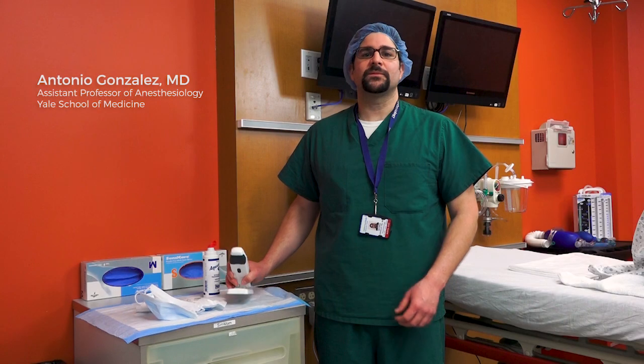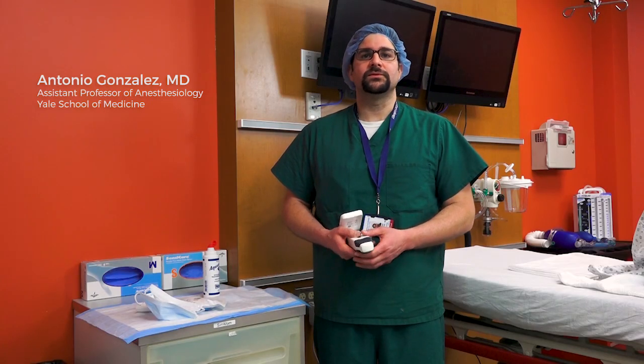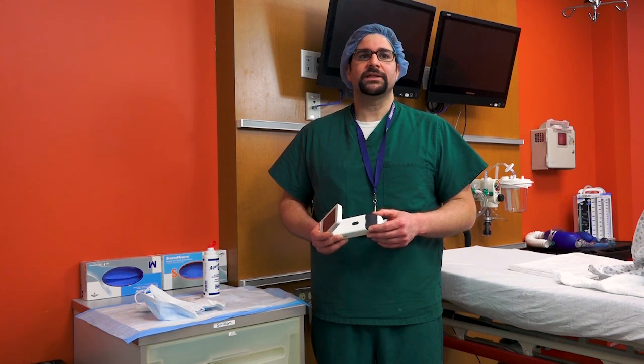Hi, I'm Dr. Gonzalez from Yale University Hospital, and today I'm going to guide you on how to use the Acuro, a new ultrasound guidance device meant to enhance neuraxial anesthesia placement.